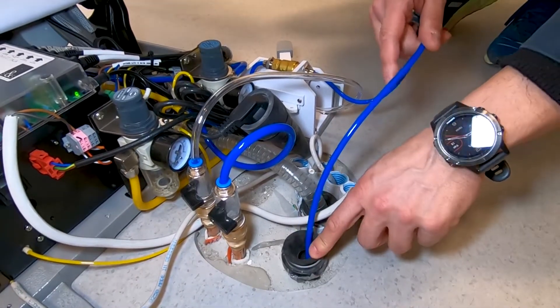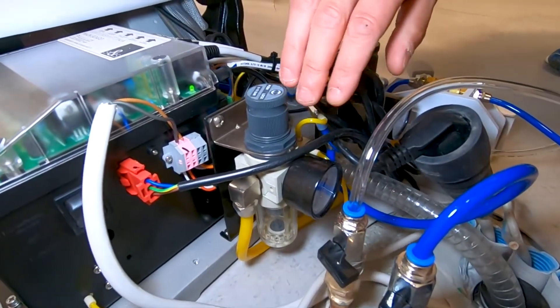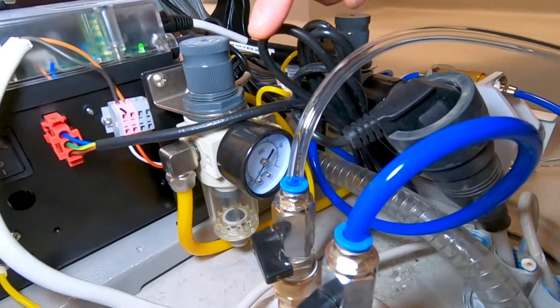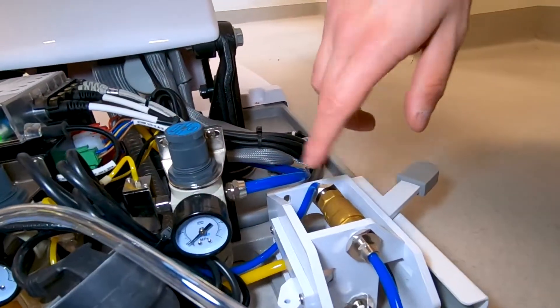Considering that we have the drain, we can just put it inside. Here we have the air pressure valve that you would normally set to six or five bar, and the water valve that we apply around two bar — now it is off.